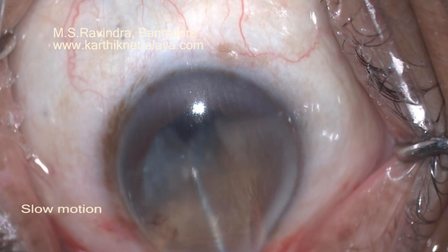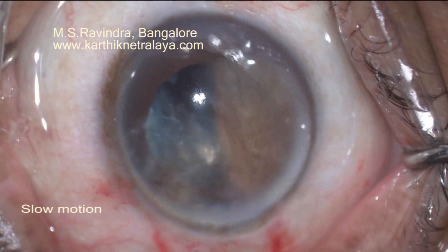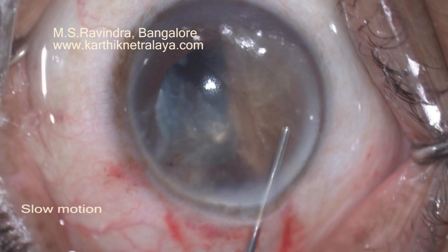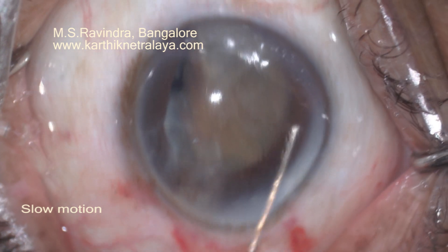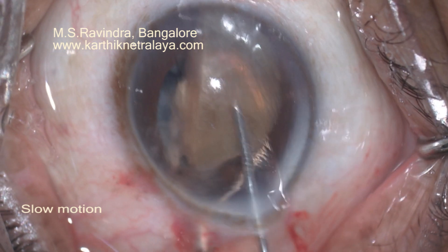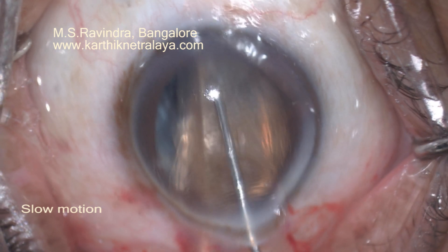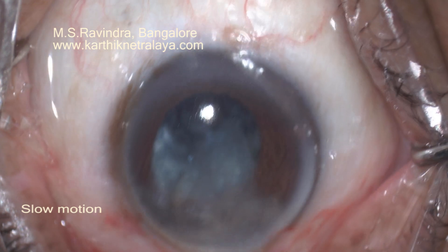The nucleus can also be trisected if needed. After cortical aspiration, a lens will be implanted in the capsular bag and there is no need to suture the tunnel. This tunnel produces less than half a diopter of astigmatism because it's not stretched during surgery. It's important to ensure that the iris is not caught between the lens and the microvectis to avoid iridodialysis. Surgery is done under topical and intracameral lignocaine.